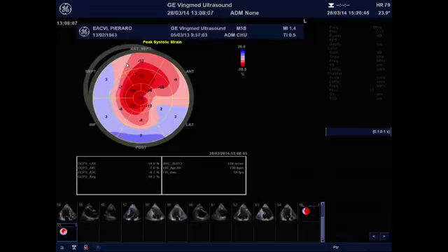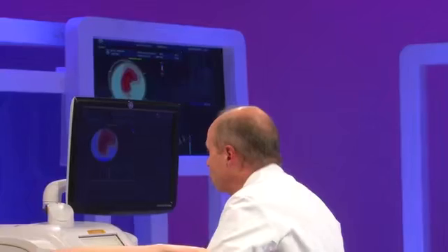So let's look now at the bullseye of longitudinal deformation at peak exercise, where, if we compare it with rest, there is clearly abnormal strain, abnormal deformation in a large territory, perhaps with the exception of the apex, which may be strange, but clearly at the level of the anterior wall, lateral wall, posterior wall. This suggests that although it was not really evident from grayscale images and the qualitative interpretation, there are signs of multivessel coronary artery disease in this patient who had a previous completely silent inferior infarction. And so, of course, there is no doubt that coronary arteriography is required.